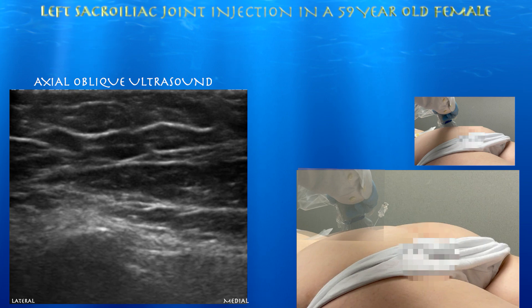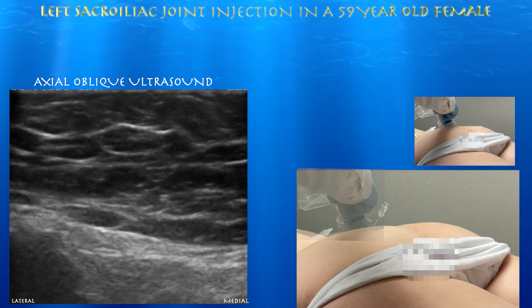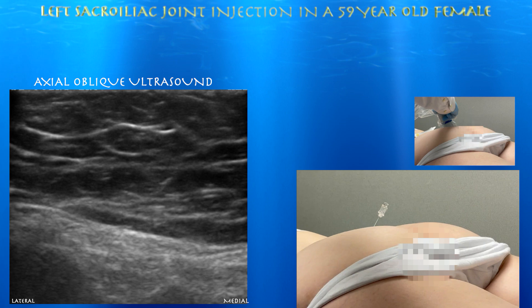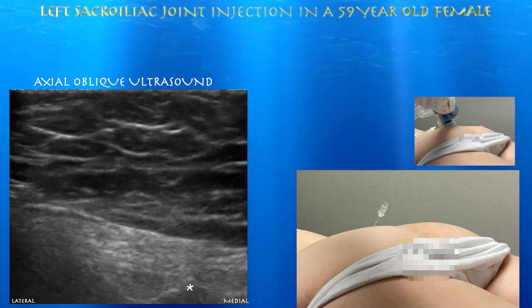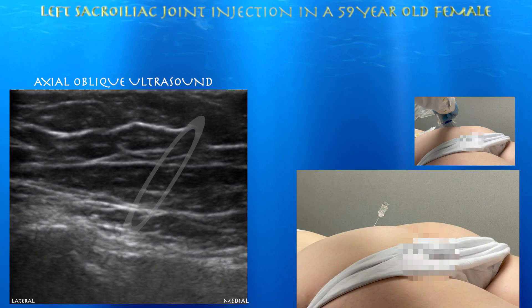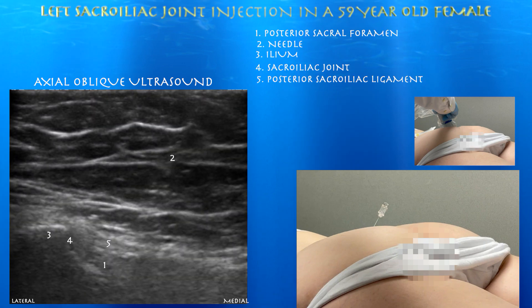Now we're going into the procedure itself. You can see the bony structures on the bottom of the screen. The delineations show the posterior sacral foramen labeled as number one, and to the left of that is the actual sacral iliac joint. To the right of the posterior sacral foramen is the medial sacral crest. You can also appreciate the posterior sacral iliac ligament. Here's the needle coming in from the upper right corner at a fairly steep angle, heading towards that sacral iliac joint.